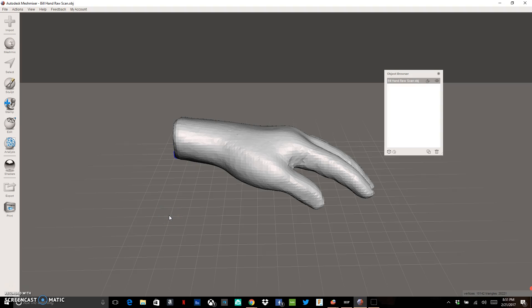The goal of this video is to show you how to import a 3D scan into Meshmixer, how to orient it properly and get the scaling correct, and how to do some basic editing to make it look a little bit more realistic and to make it printable.